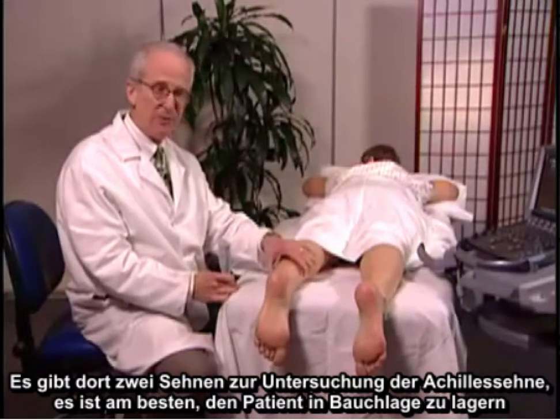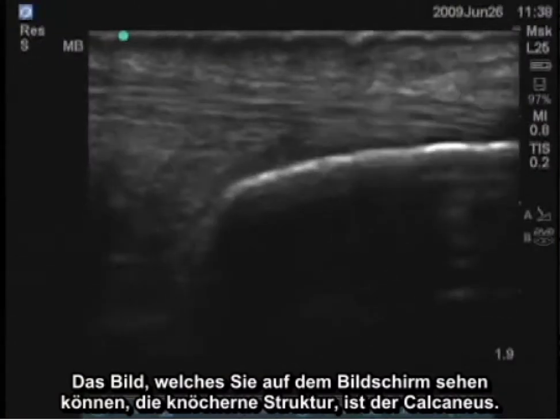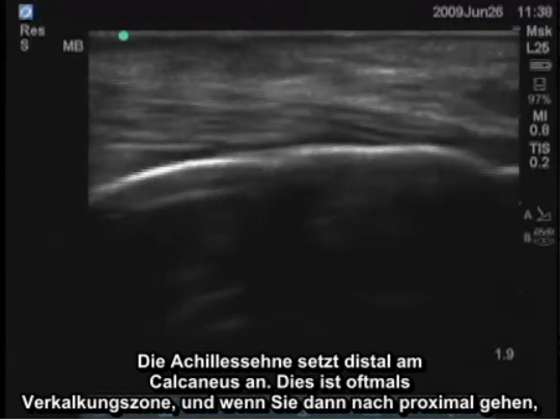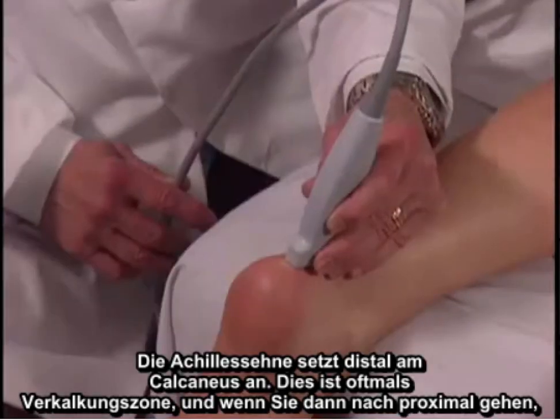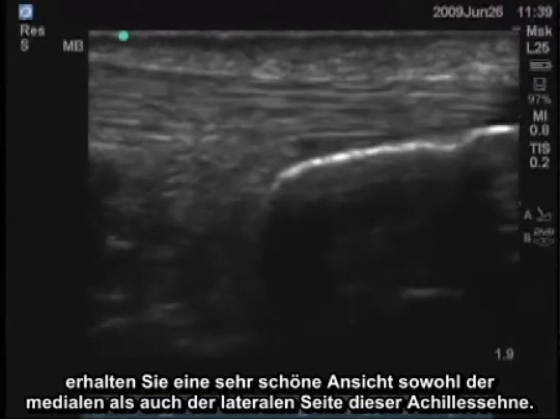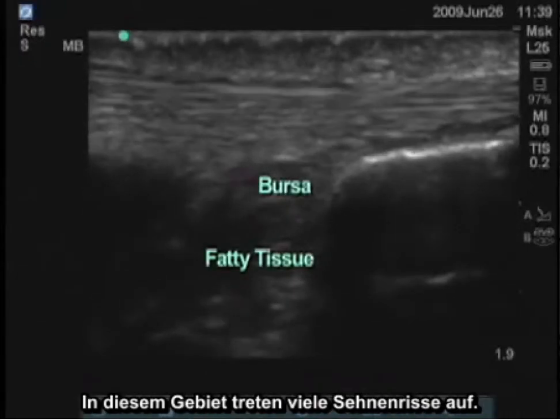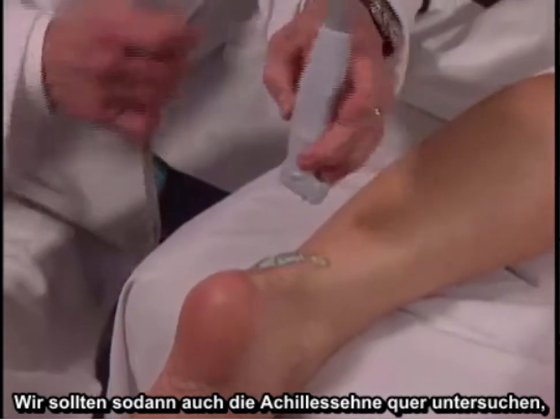For examination of the Achilles tendon, it's best to have the patient in the prone position with the Achilles tendon lined up. The bony structure on screen is the calcaneus, and the Achilles tendon is inserting into the calcaneus distally — this is a frequent zone of calcification. Going proximally, you can get a very nice view both medially and laterally of the Achilles tendon. Structures deeper to the tendon include a bursa and fatty tissue. This is the area where many tendon tears occur.